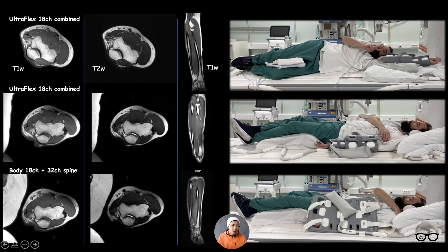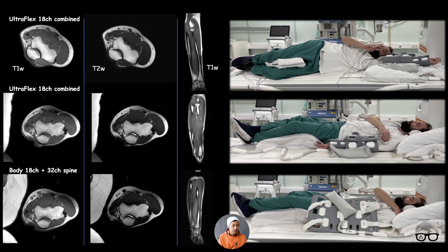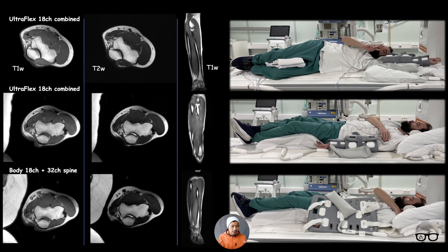The first position is the arm forward — kind of a superman position. The next one is arm downwards, which is a more comfortable way, though a little more challenging if the patient is large because you need to have the arm at isocenter. The last one I tried out of curiosity — whether the large Body 18 flex coil could handle this type of imaging.